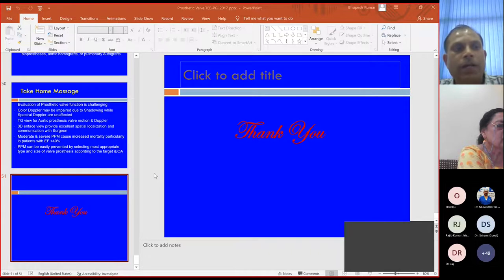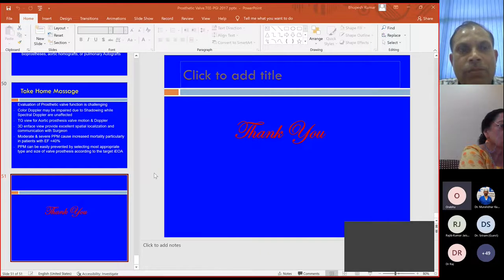No, bileaflet valve, if you are asking about the gradients, the only thing you need to take care of while measuring the gradient is that the continuous wave Doppler should not pass through the central orifice of the bileaflet valve. So you align such that it passes through the larger orifice. If it is not possible, you can use pulse wave Doppler also.